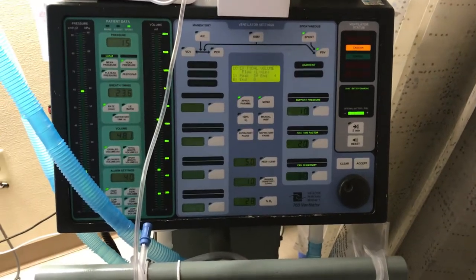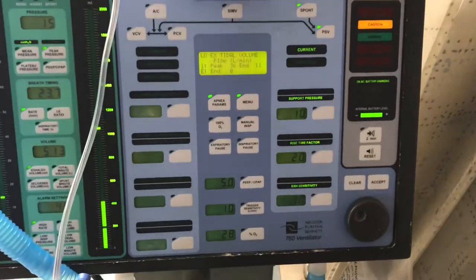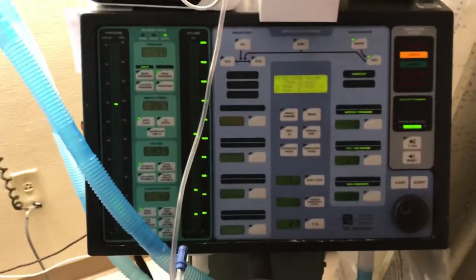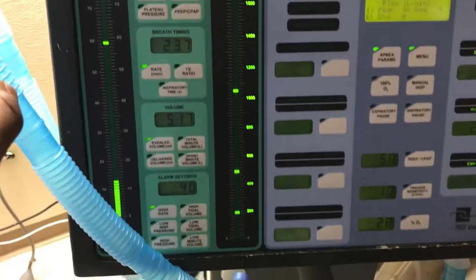This is one of the ventilators we've been using — the Puritan Bennett 760 ventilator. As you can see, it has all of the functionalities that a ventilator is supposed to have.